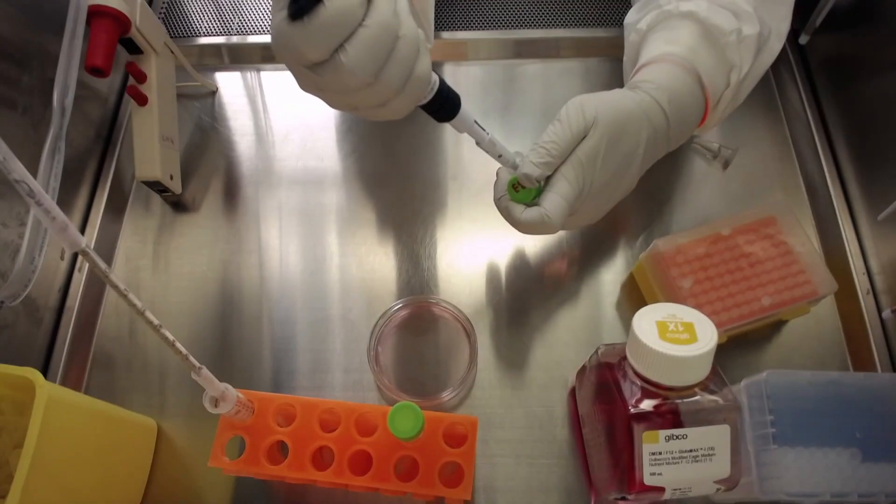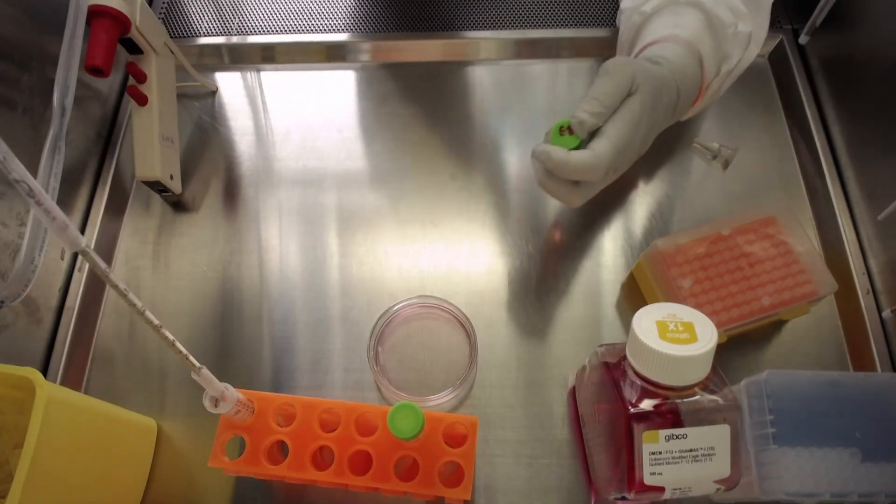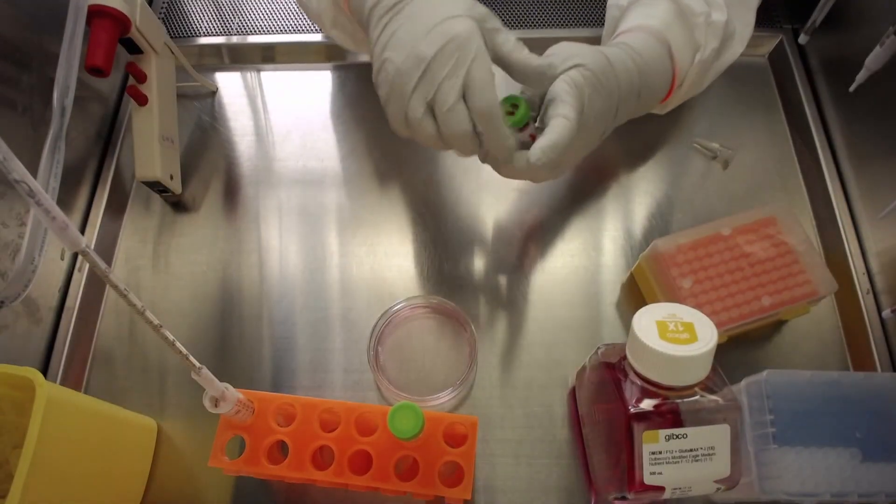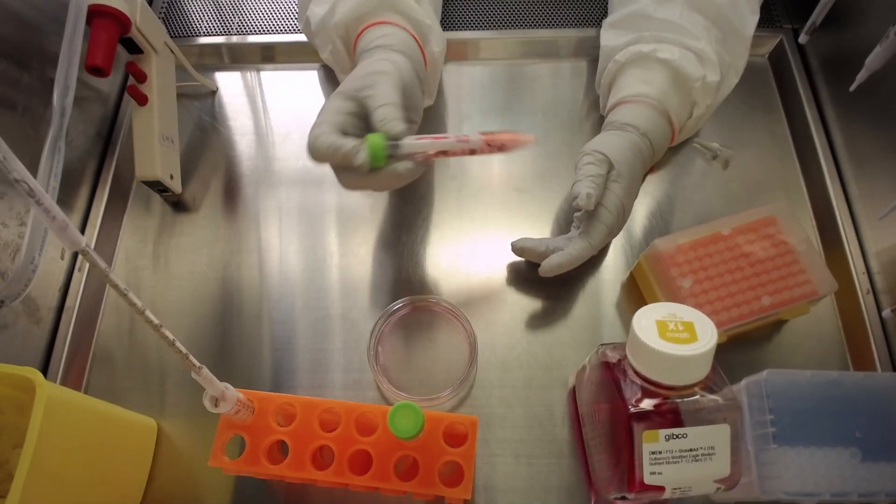Prepare 8 milliliters of the appropriate iPSC culture media supplemented with 10 micromoles of rock inhibitor. Replace the cap and invert the tube a few times to mix.